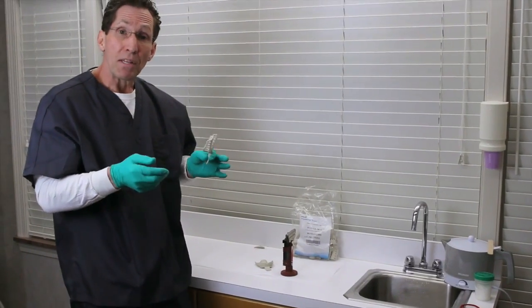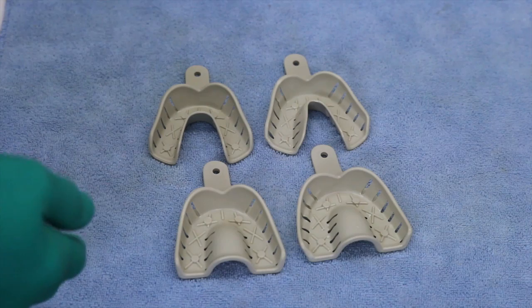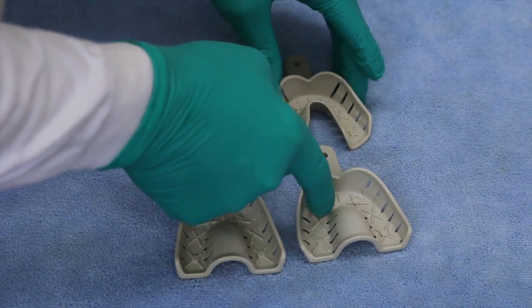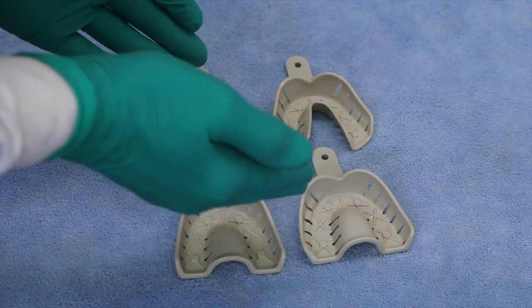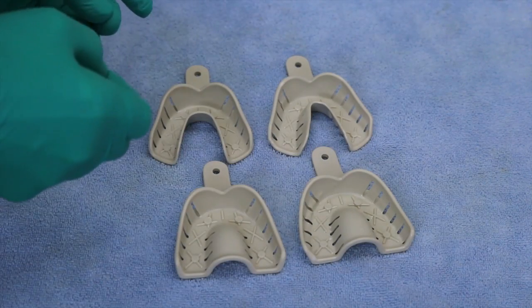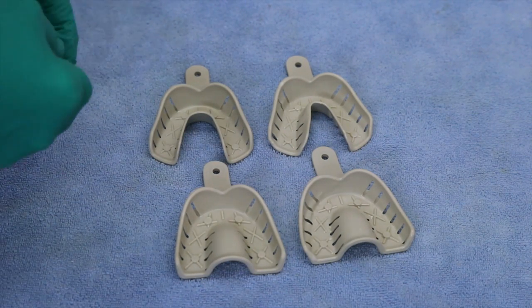If we can take a break here, I'll show you a comparison of this to an unmodified tray. And here we see the results of the modifications we made in the trays in our previous segment. On your left-hand side, you will see the original trays unmodified. And on the right-hand side, we'll see the modifications we made. Now this is just a generic modification we've made, and again, this is what I just demonstrated to you a few moments ago. We will do this routinely on our trays as they come in. These modifications seem to be a good starting point for us to customize in the patient's mouth. Ultimately, the actual shape that we will use in the patient's mouth will be dependent upon the patient's anatomy, certainly.